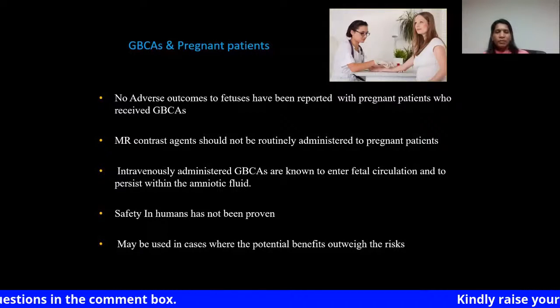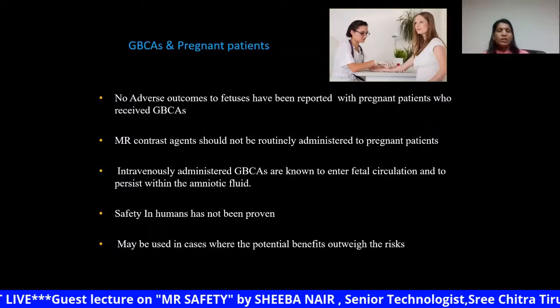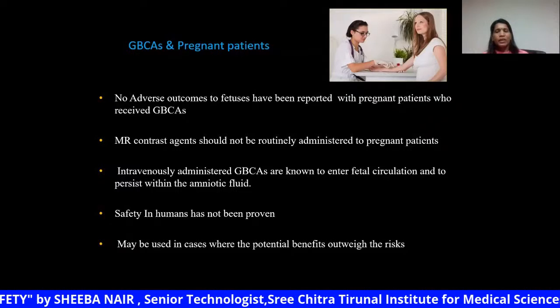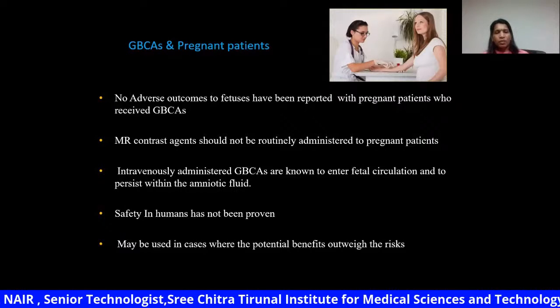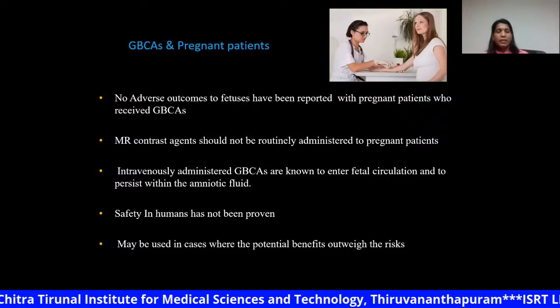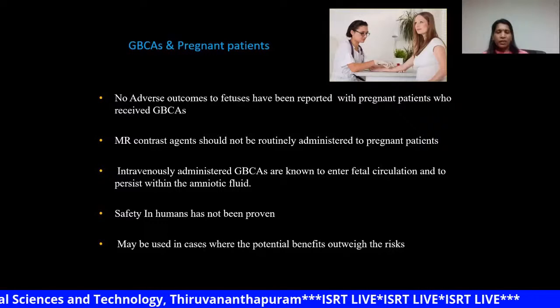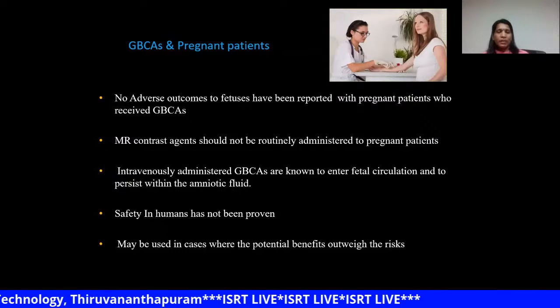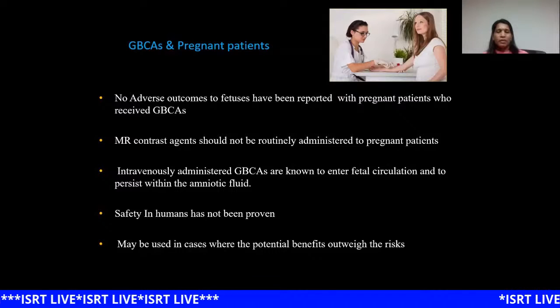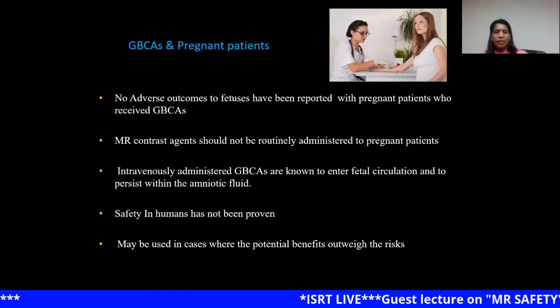Still, its risks are not completely excluded. So intravenous gadolinium contrast agent should not be given to a pregnant patient routinely. But if there is a clinical need of giving contrast agents to the mother, especially if a malignancy has to be ruled out, then we can give the contrast agents to the pregnant patient.